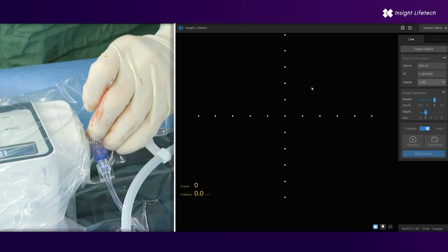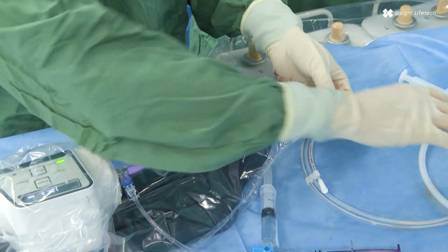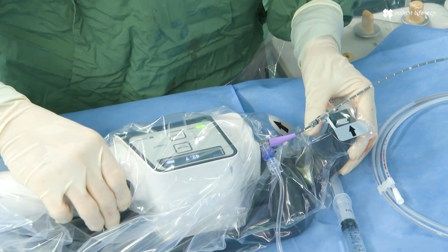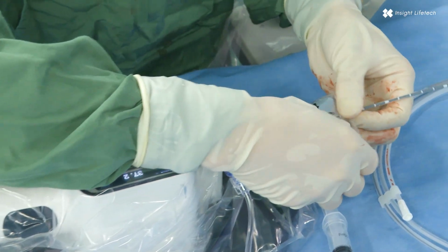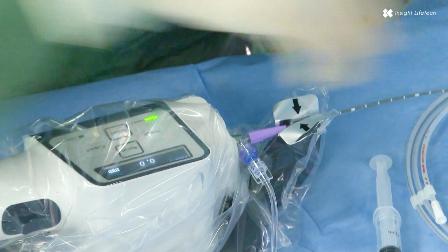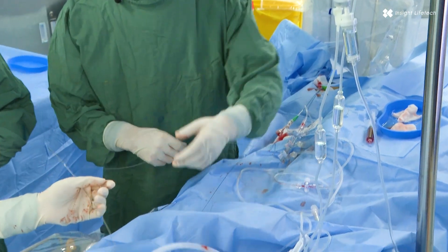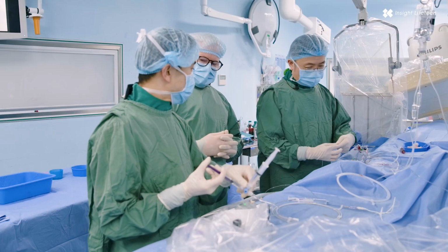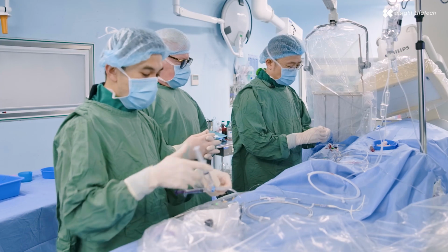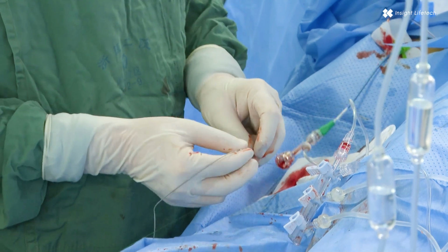So you see now the preparation of the high definition IVUS catheter. The special feature of this device is the long pullback, 15 centimeter pullback. So with one pullback, you can assess all along the vessel. And there are 4 speeds of the pullback available: 0.5, 1, 5, and 10 millimeter per second. So especially in very tight lesions, you can shorten the time of the evaluation.